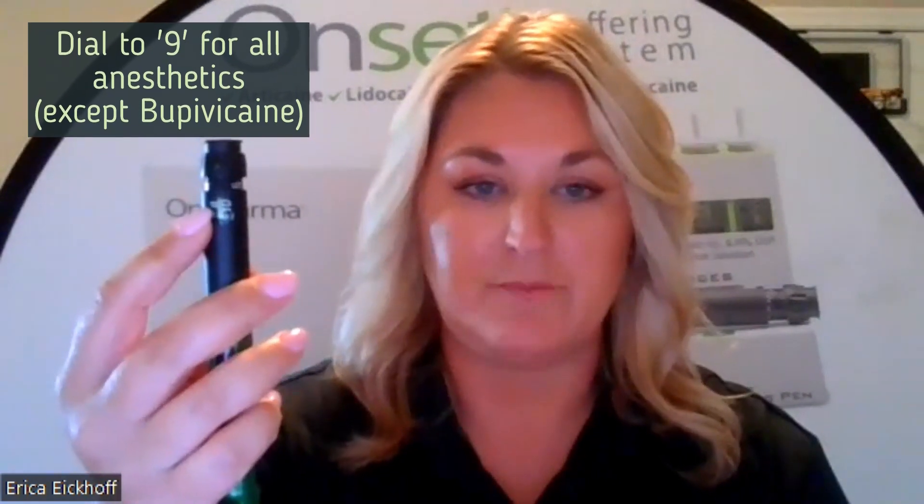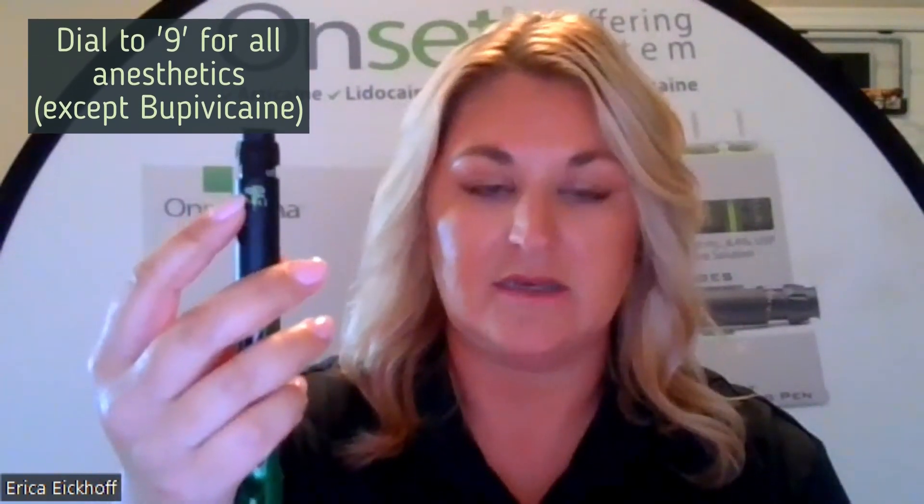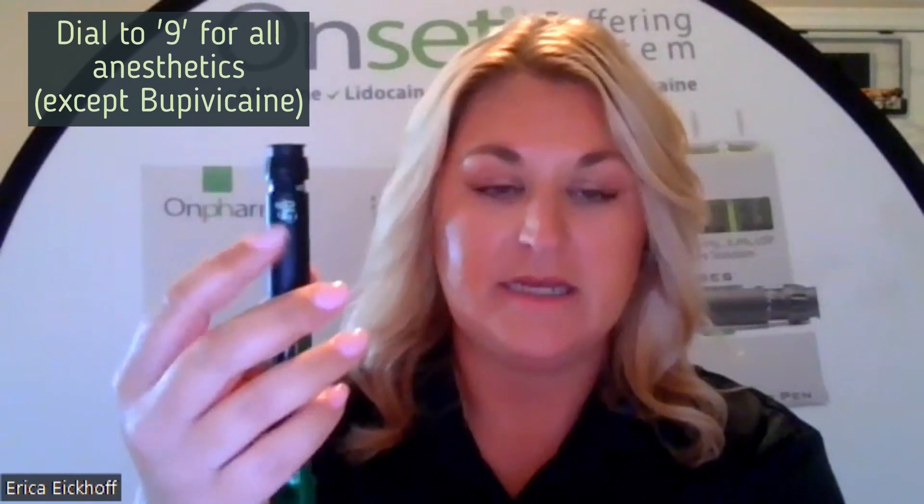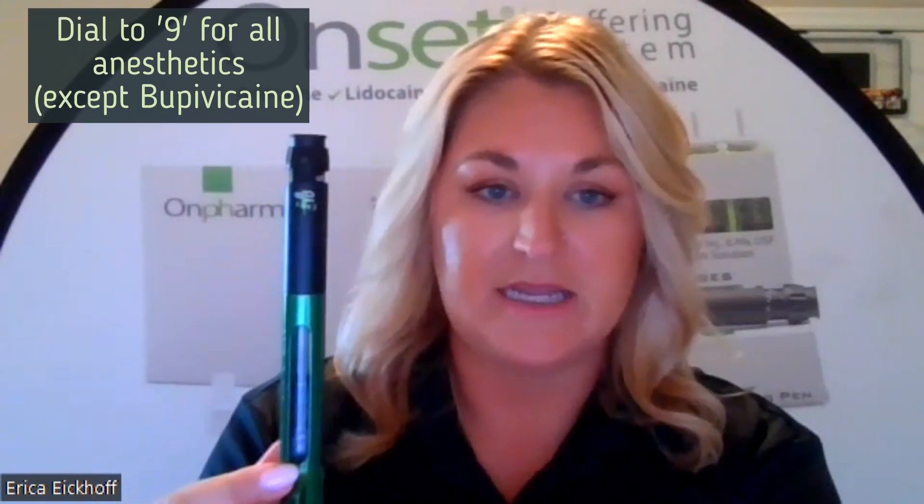First up, we have our mixing pen. You'll notice there is a dial at the top with the numbers 0 to 60. The only number that we need to know from that dial is the number 9. Each time that we buffer our anesthetic, no matter what anesthetic it is, we are always going to dial to 9 before we do so.